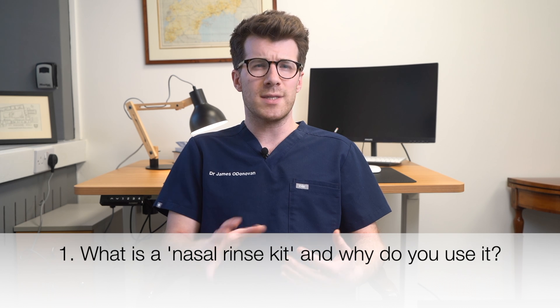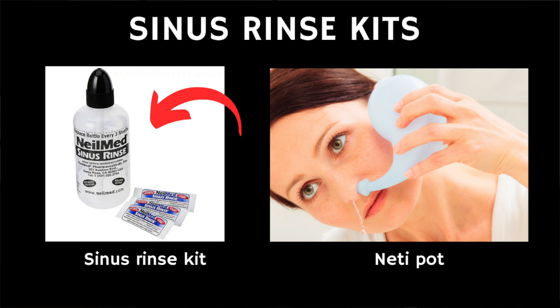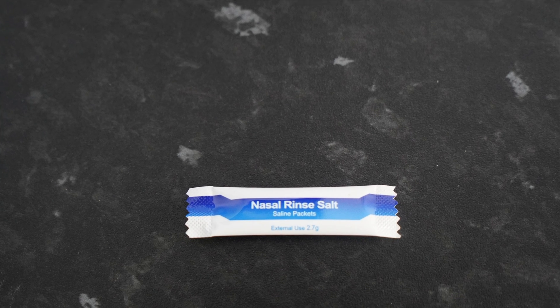So let's briefly explore what a nasal irrigation set is and why you would use it. A nasal irrigation set, commonly referred to as a nasal wash or sinus rinse kit, is a device designed to rinse the nasal cavity with a saline solution. It typically consists of a bottle like a NeilMed Sinus Rinse kit, or a pot often resembling a small teapot like a neti pot, along with packets of a saline mixture.